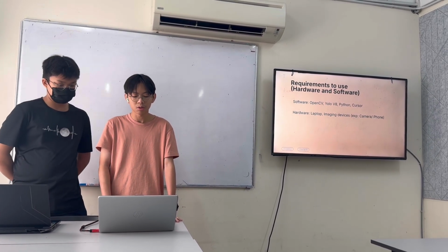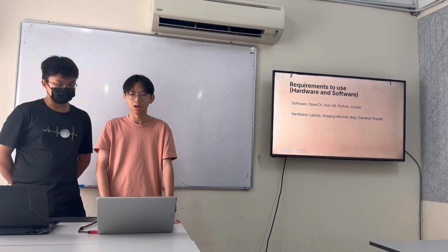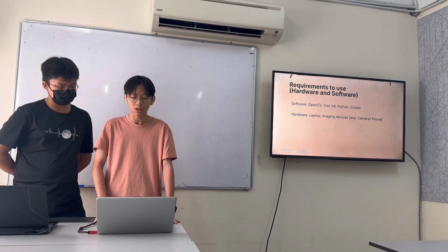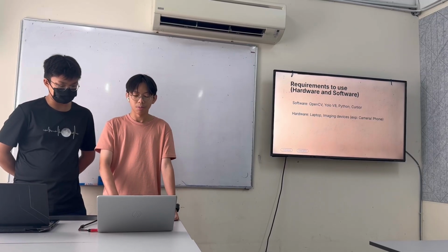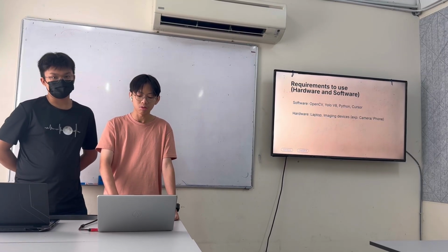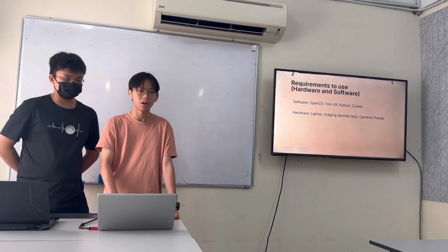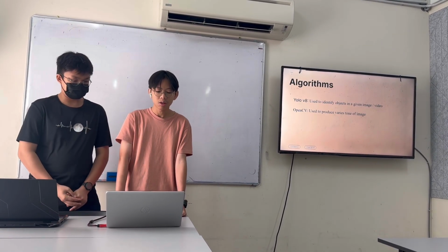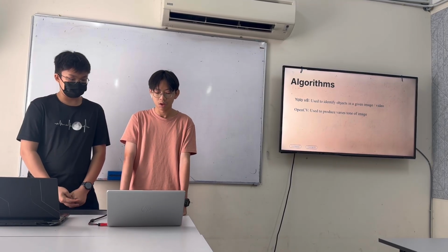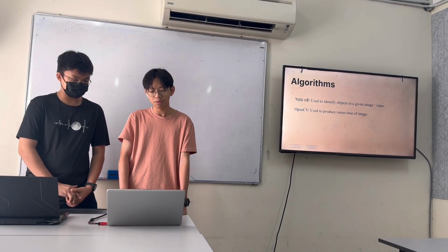So the hardware we use is a laptop to run the website, and an imaging device like a camera or phone, which you might need for real-time diagnosis. It is easy to capture inputs. And the algorithms we use are YOLO V8, as we said, and OpenCV.